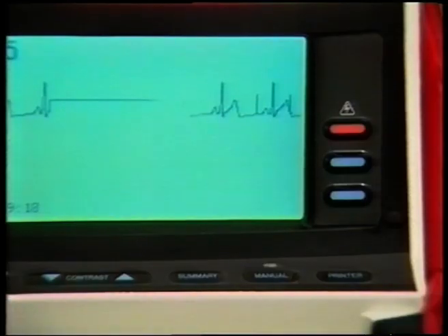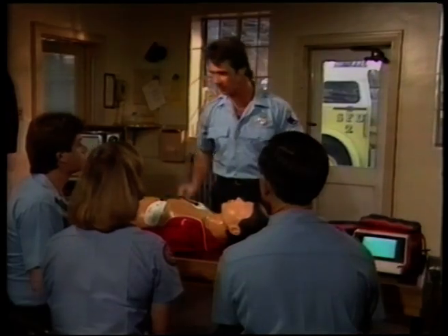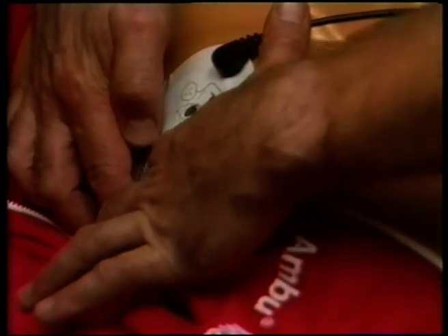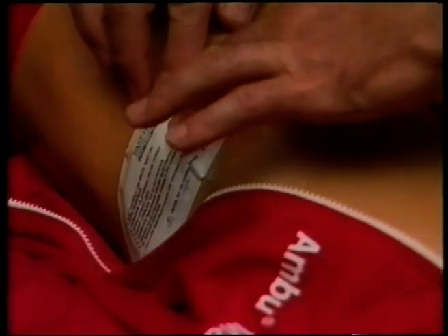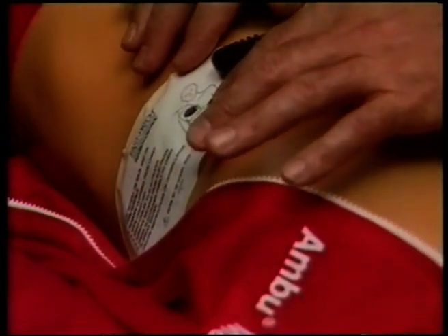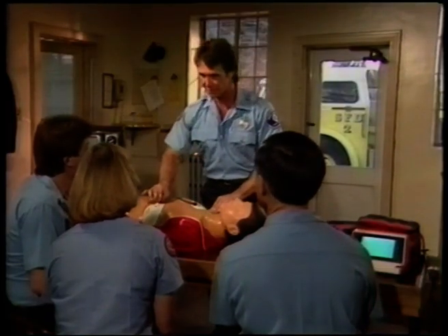If you see the Connect Electrodes display message, check the following 3 connection points. First, the electrode to patient adhesion. Make sure that the electrode is adhering to the patient's skin by pressing down firmly on the electrode and around its edges. The skin should be wiped dry and excessive patient chest hair should be shaved or clipped in the electrode placement areas before applying the electrodes.